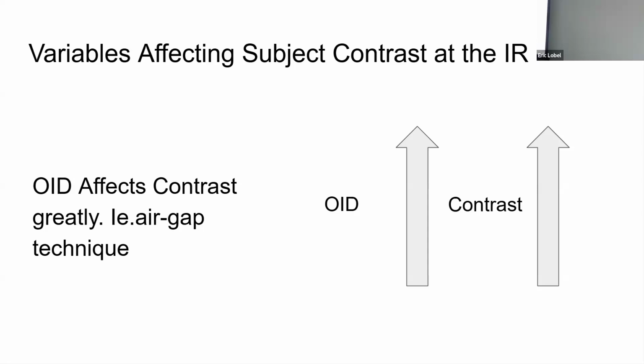But the biggest issue I saw a lot was the breathing instructions. I think part of that was because students ran away when they realized the other student was about to take the image, whether they said X-ray or not. So I think that may have affected the person taking the X-ray such that they didn't say X-ray. They just went right into the breathing instructions. I also saw a mix-up a few times. It's supposed to be X-ray, then you do your breathing instructions, then you say breathe, then you say clear. I saw a lot of clears, and then I'm still waiting for them to tell the patient to breathe.